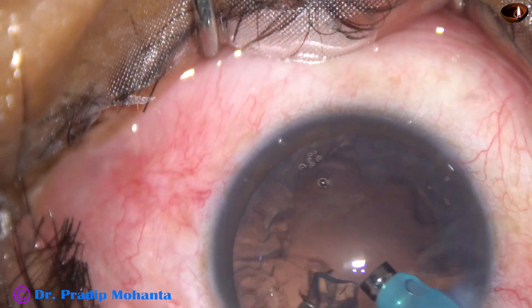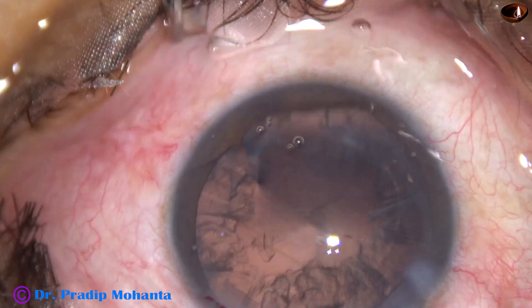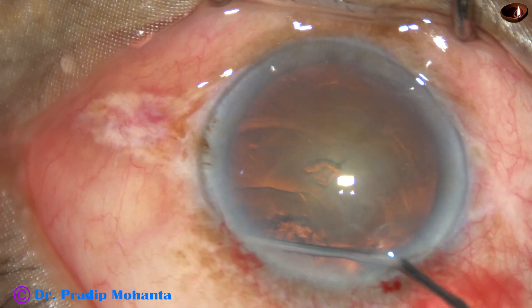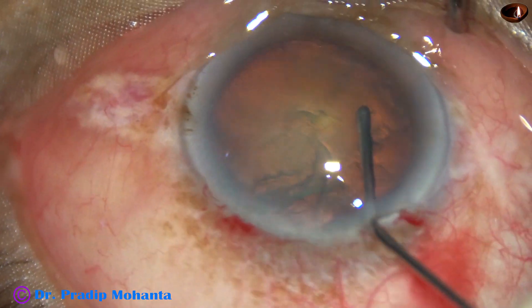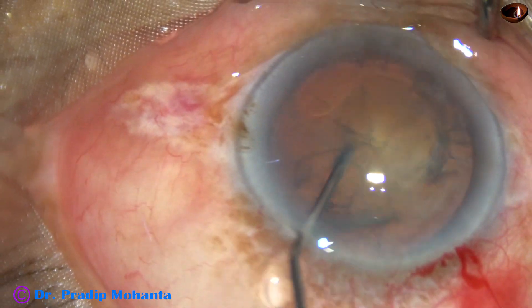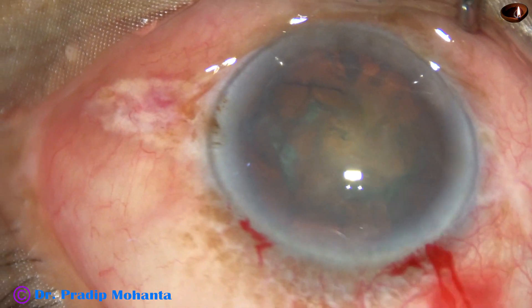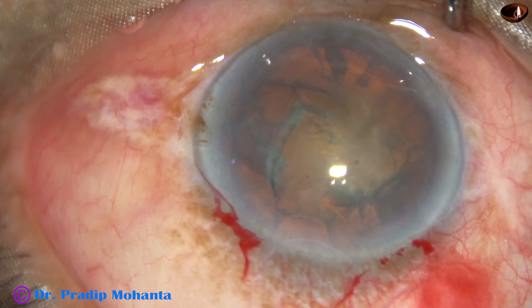But if the nucleus is a little harder, we should divide the nucleus into several pieces. You can see this is a case with grade 2 plus nucleus sclerosis — not a very hard cataract. How deep to go to hold this nucleus?